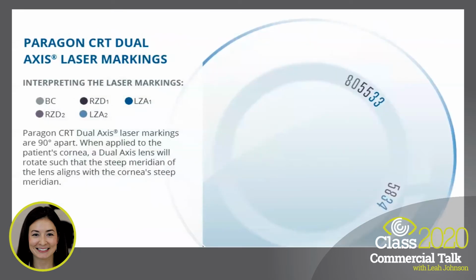So this is also a schematic of a CRT dual axis lens with laser markings etched inside the RZD. You can see, as before, it's similar to the spherical lenses where it has the first 6 digits representing the base curve, the RZD1, and the LZA1. However, with a dual axis lens, there will be 2 sets of laser markings. The second block represents the RZD2 and the LZA2. Once again, don't worry, we'll discuss more about these parameters later on in this lecture.